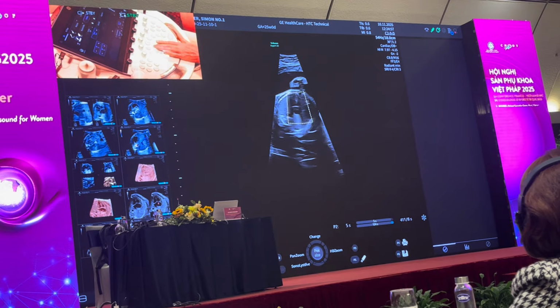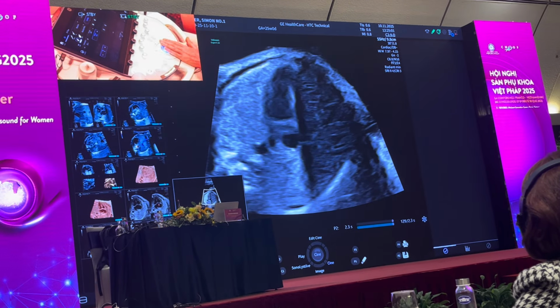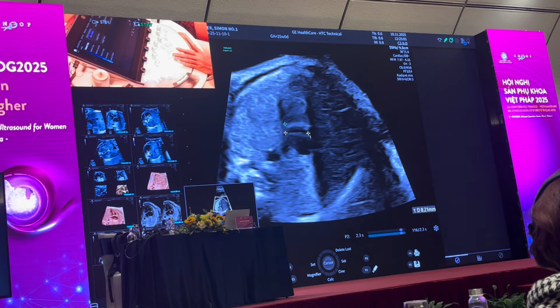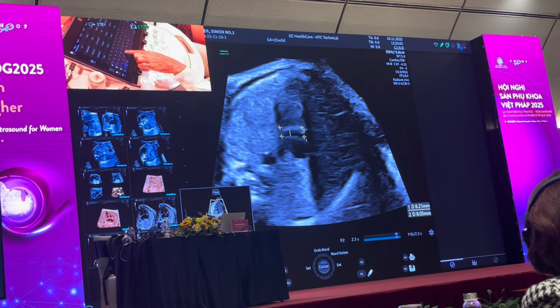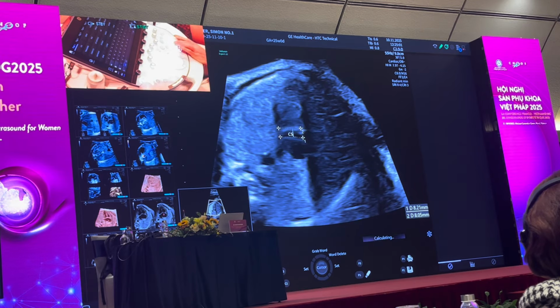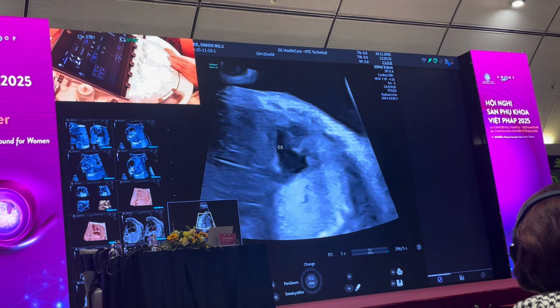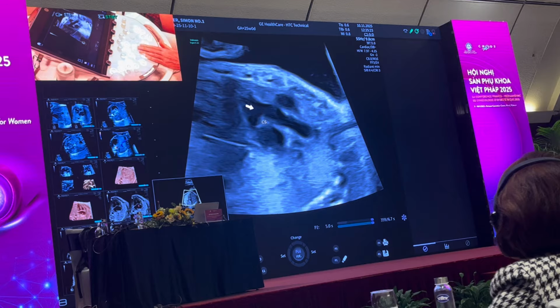So I have not got a left ventricular outflow tract, so I want to look at this. I forgot to show you in the four chamber view of the heart that this structure here is the coronary sinus. So this is the coronary sinus on the inferior surface of the heart. So you go from the four chamber view and then you go down, and the coronary sinus comes into view. And when coming up to the left ventricular outflow tract, you rotate the transducer and you demonstrate that the aorta comes out of the left ventricle.